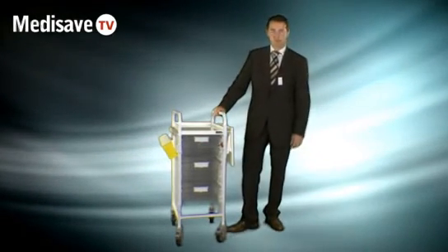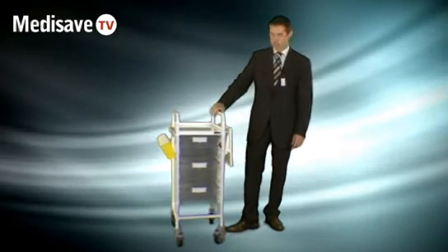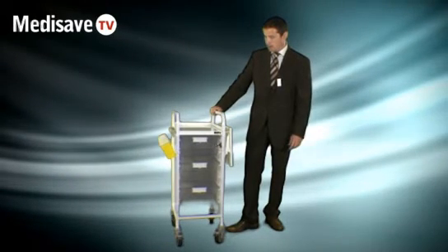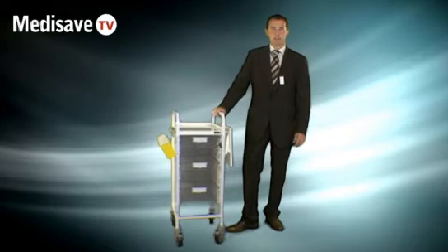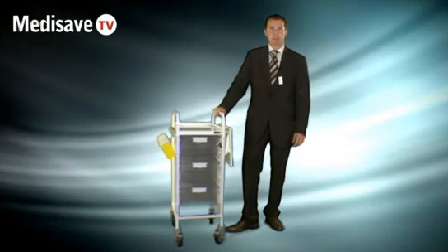Other options include buffers for the bottom to protect the fabric of the building. This is the Sunflower range of Vista trolleys. You can find out more details on the MediSave website. Thank you very much.